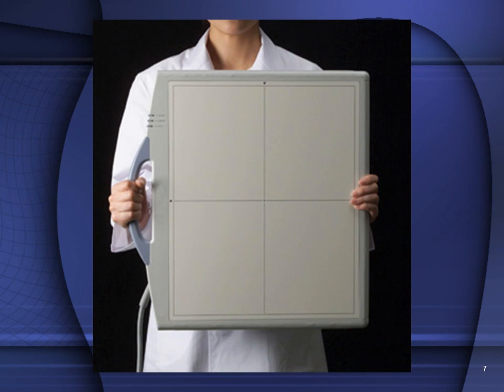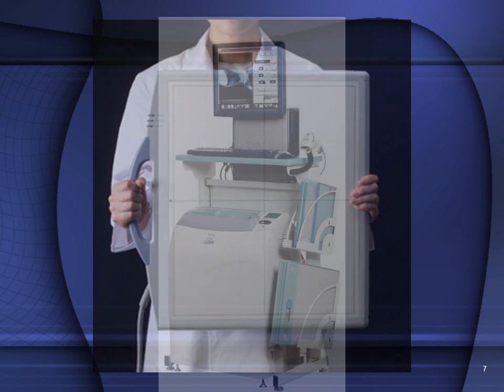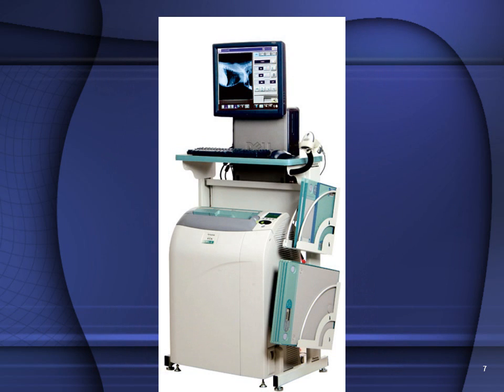This is an example of the digital cassette that's used in modern radiography. And this is a digital cassette system. As you can see, the cassettes or computer chips come in various sizes, and the radiographer would select the appropriate size based on the physician's orders that specify which region of the body or what on the patient is to be radiographed. This is the cassette reader.